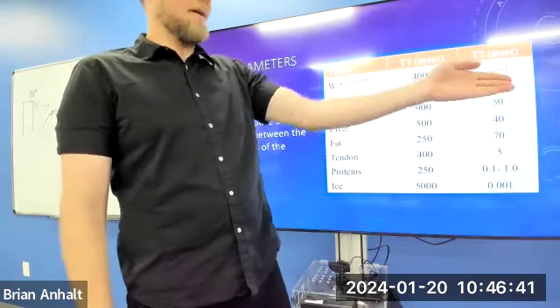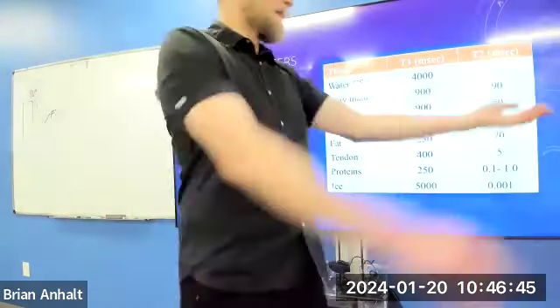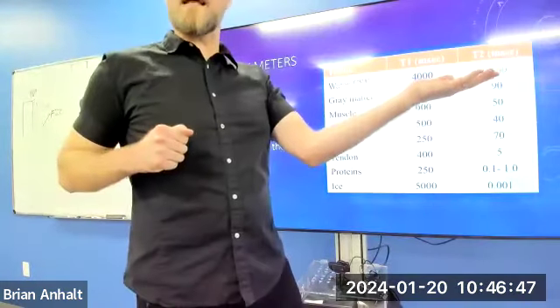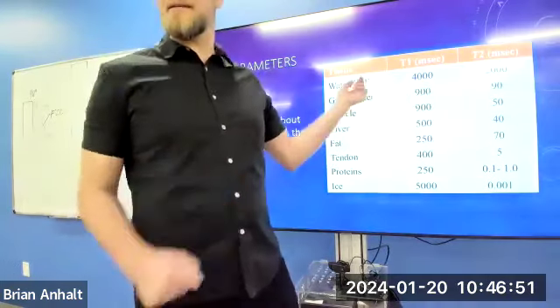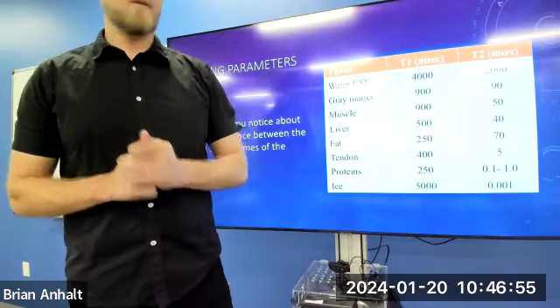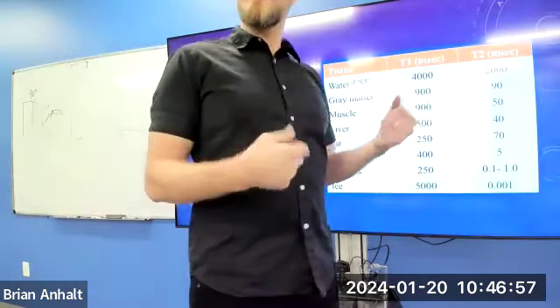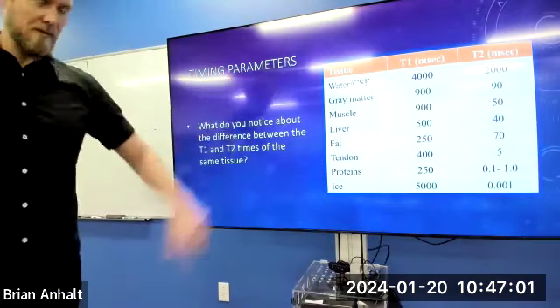It's going to be halfway there. It's still going to have a lot of transverse magnetization. Fat, on the other hand, only took 70 milliseconds. It's not going to have any transverse magnetization if we wait 1 second from excitation until we listen back to the echo. So water will look bright and fat will look dark after 1 second from excitation.